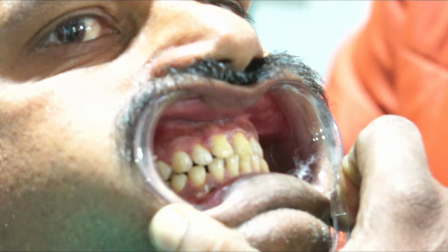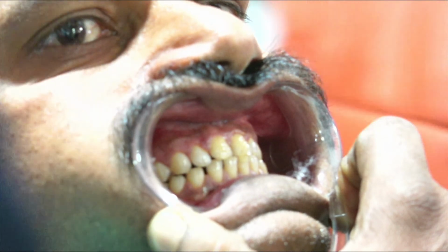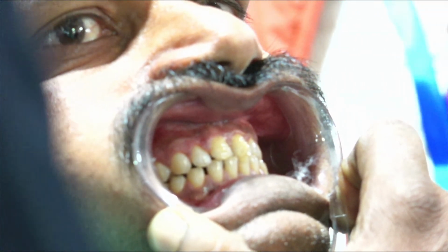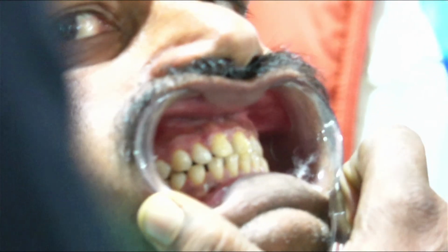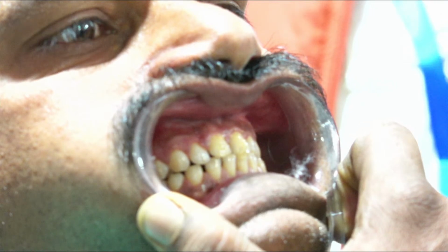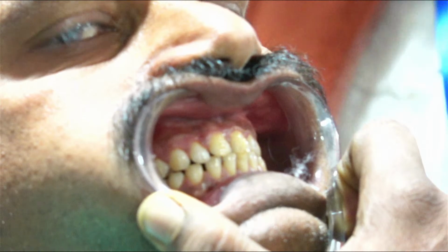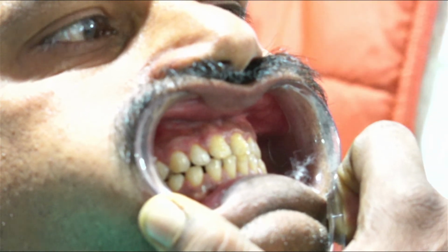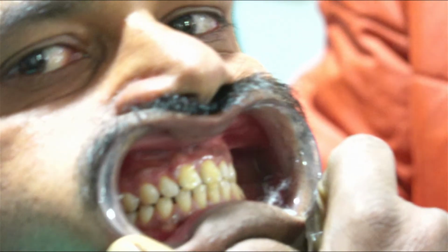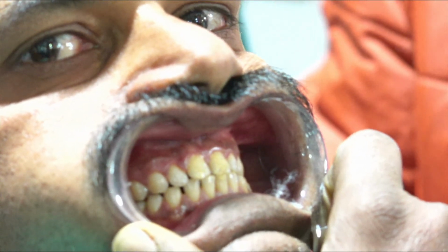Yeah, this is thermal. Exactly. It is only on the tooth, not on the gingiva, because of this prism. So now the laser machine is warm. I'm using it at 4 watts continuously, so it will warm up and it will give us a warning.